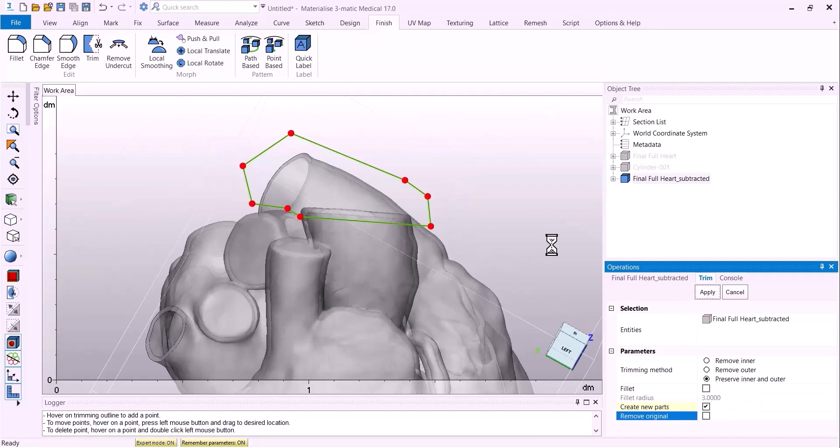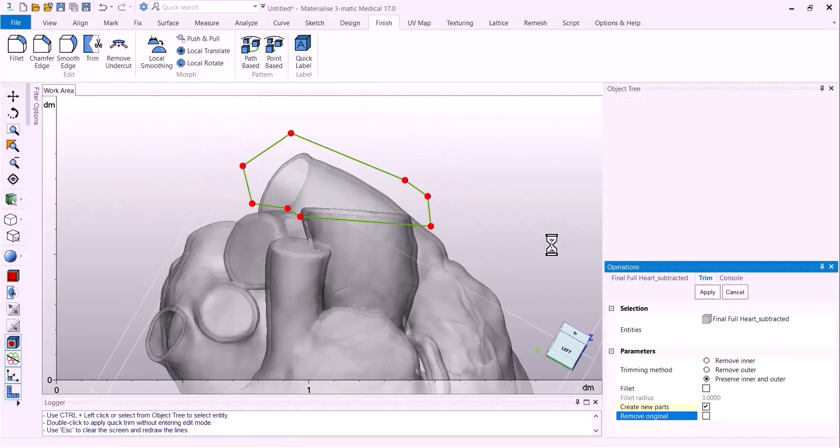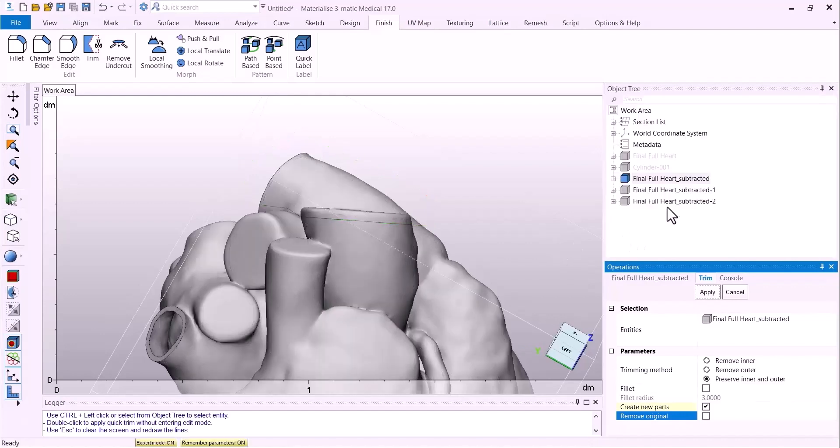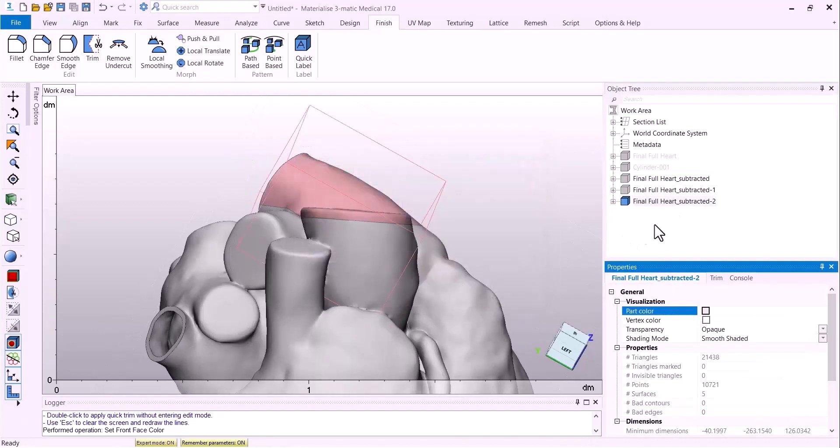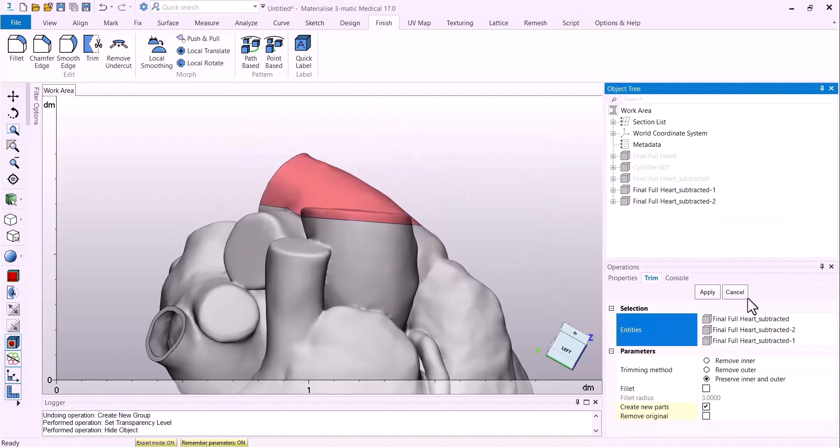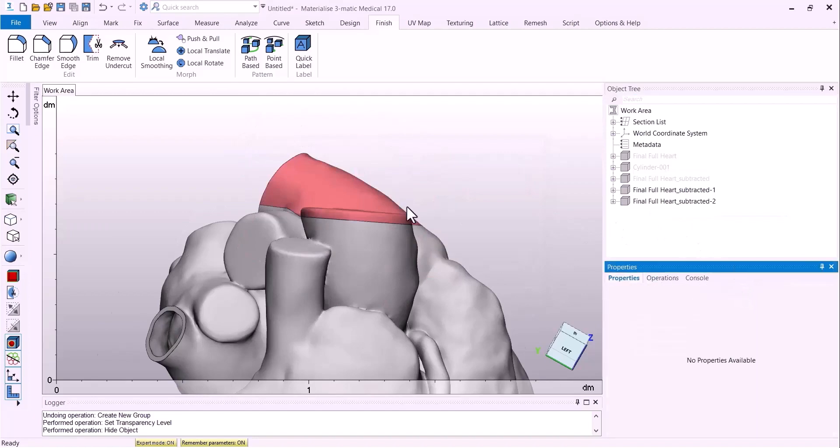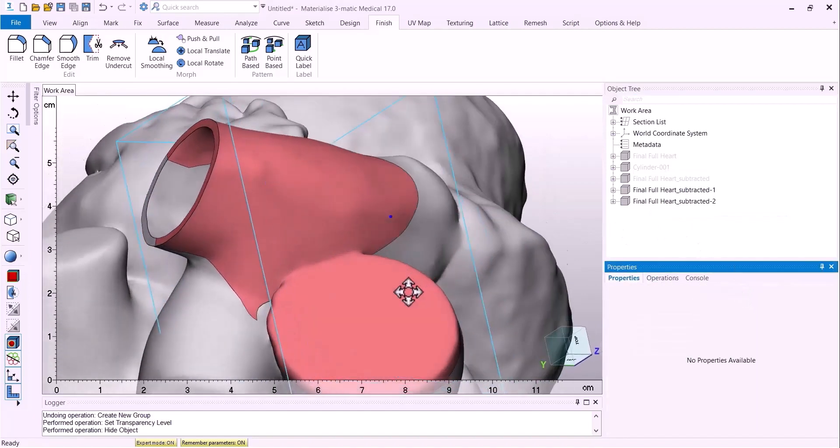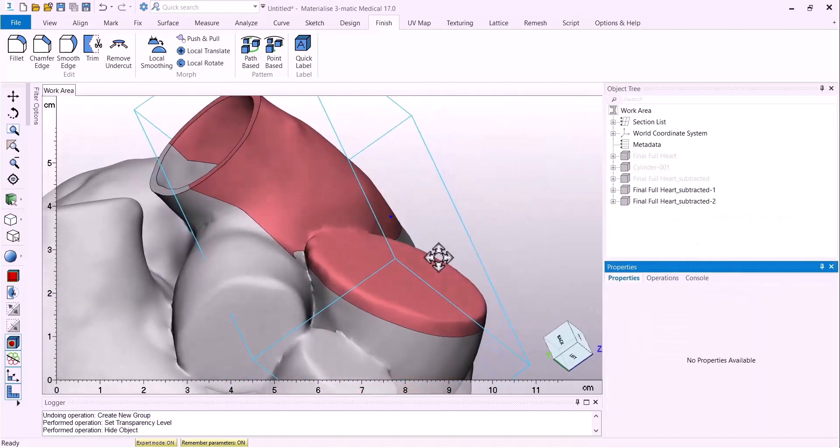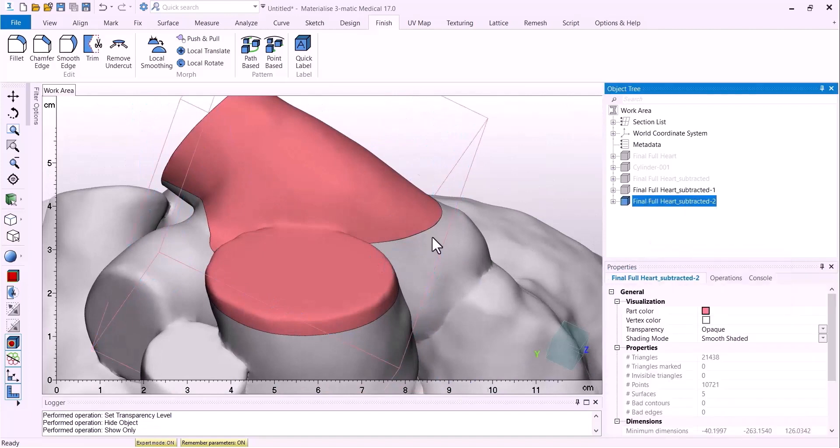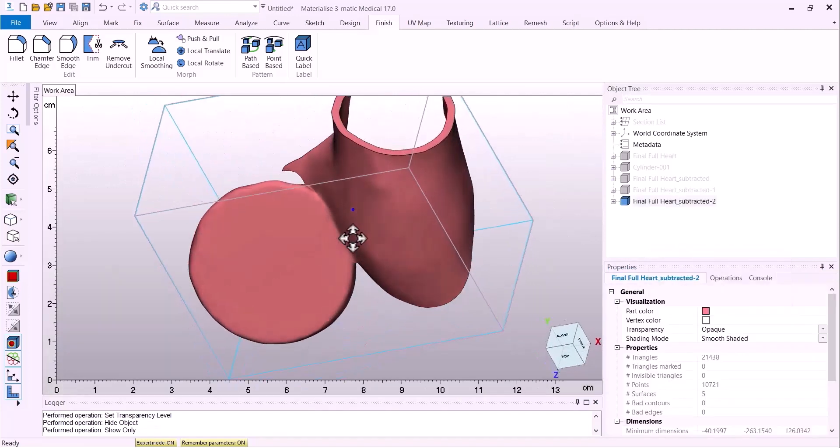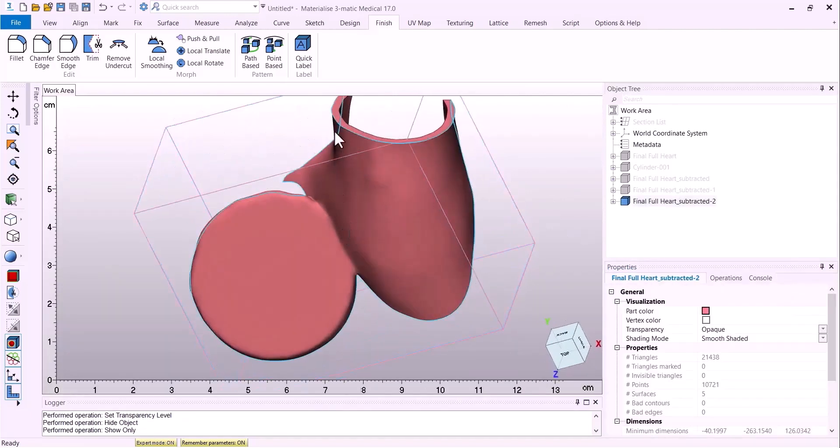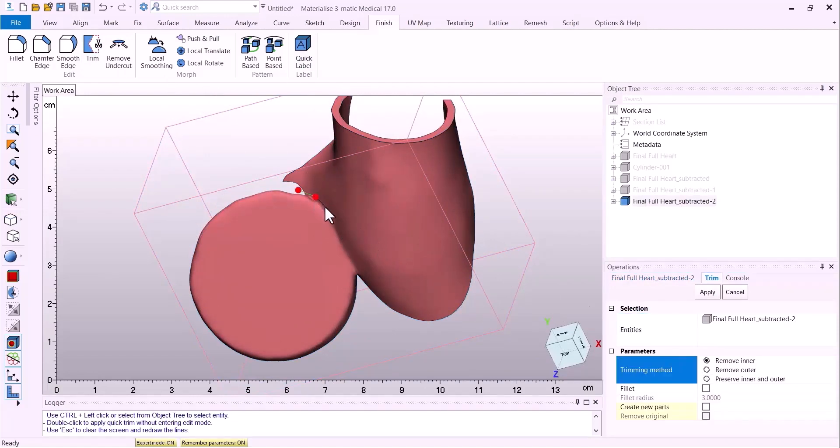This will create two models where the first one is what we will use to trim away that vessel top that we want to remove. And the other one is the original model that we will use to union this piece back on. So here we are trimming away that piece of the vessel we don't want. And this way you can move the trim tool back to remove inner.